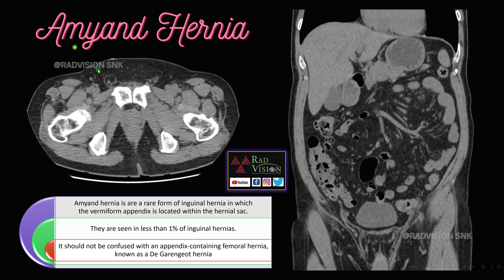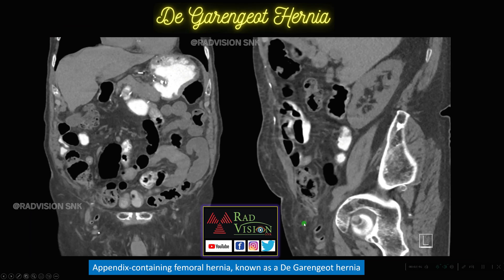Next, here you can see the appendix visualized in the right inguinal hernia — this is called Amyand hernia. Here you can see the appendix herniating into the right inguinal region. The close counterpart is de Garengeot hernia, where you can see herniation of the appendix into the femoral region — herniation of the appendix in the femoral region is called de Garengeot hernia.